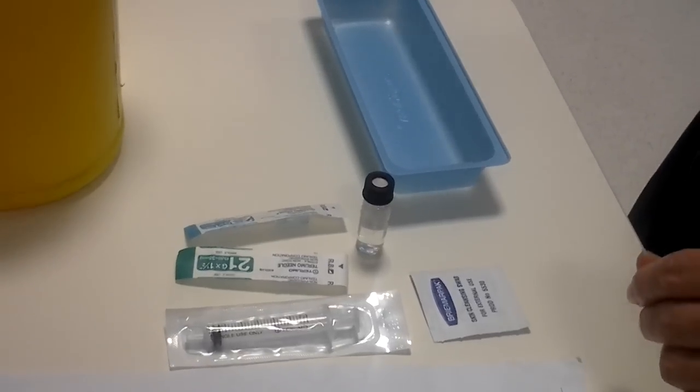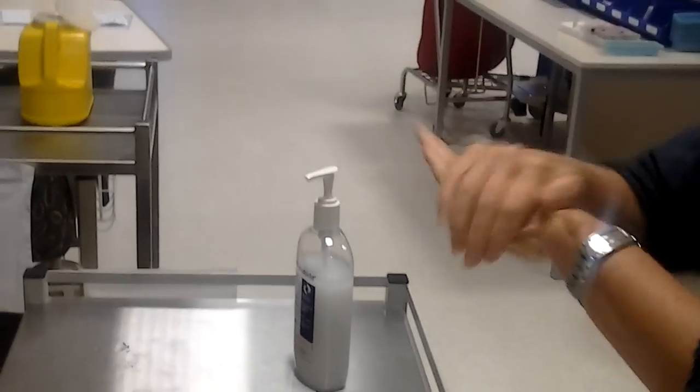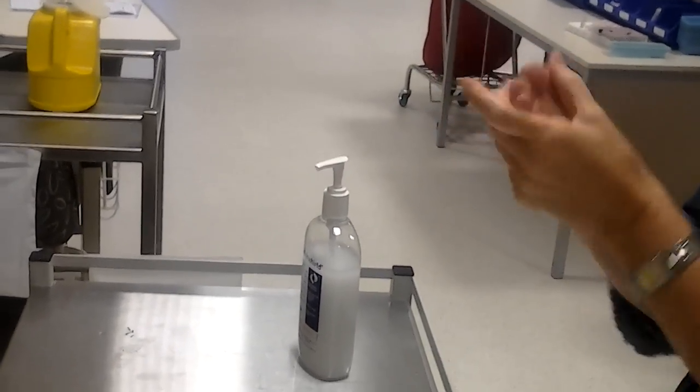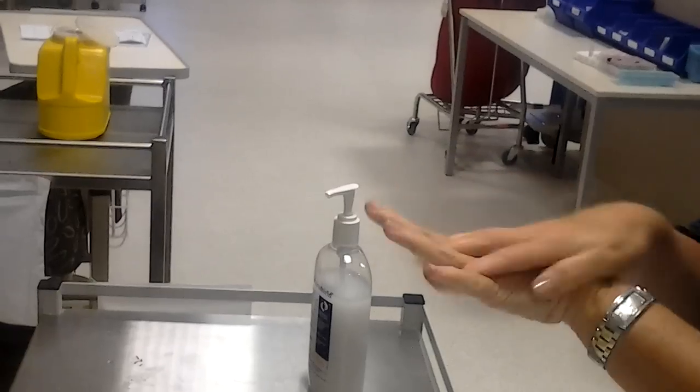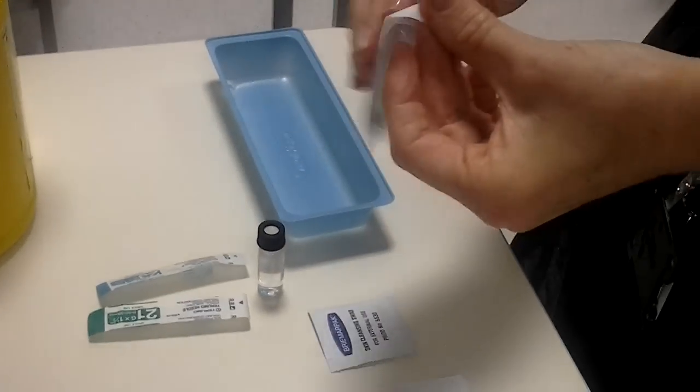Step 5. Wash your hands before beginning the procedure with an alcohol hand rub. Step 6. Assemble the equipment, maintaining an aseptic technique.